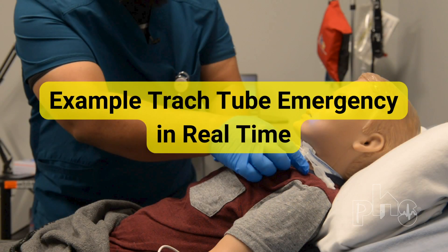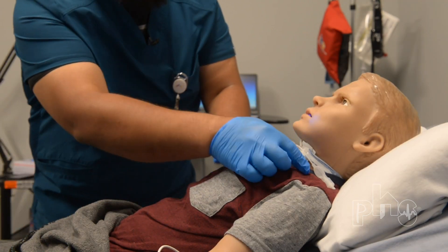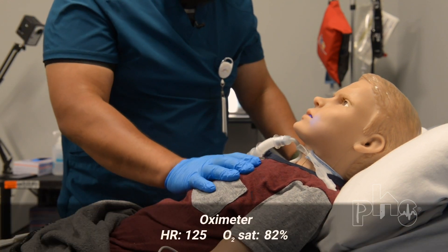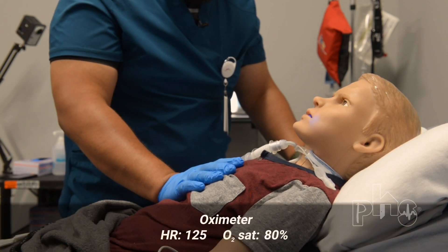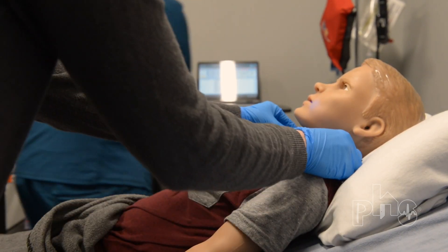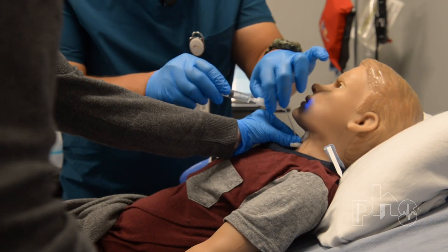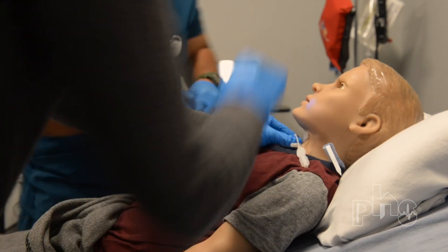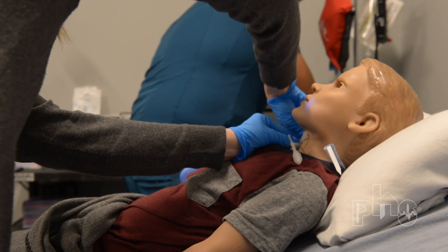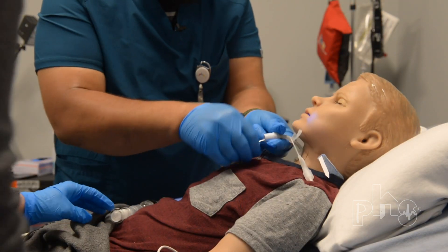Here is an example of a trach tube emergency in real time. Oh no, I pulled this trach tube out. Pal, we're right here with you, okay? We're going to help you. Mom, could you undo his trach ties? I'm just going to get his cuff deflated. I'm going to get the obturator. Now we're going to put your trach back in, okay? Here we go.